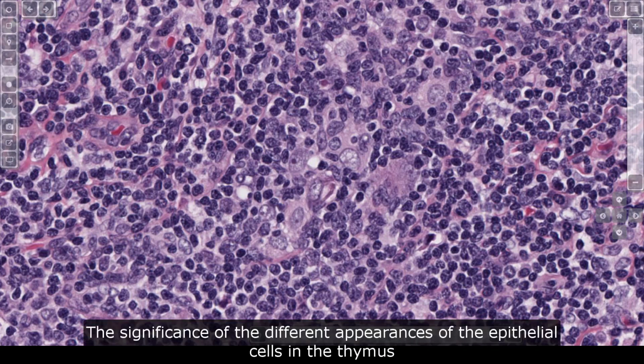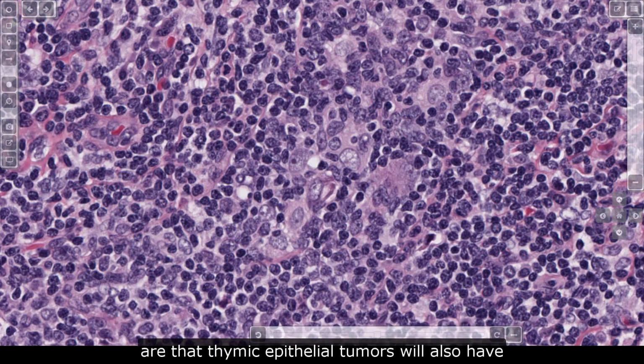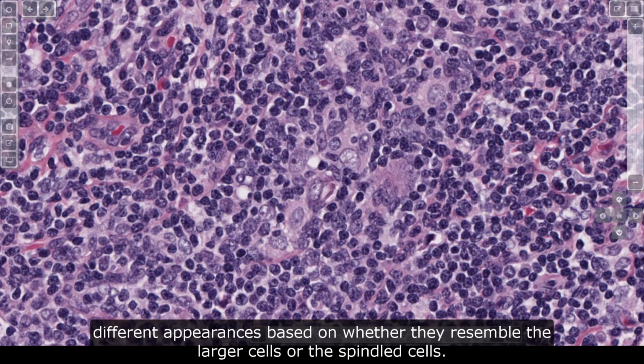The significance of the different appearances of the epithelial cells in the thymus is that thymic epithelial tumors will also have different appearances based on whether they resemble the larger cells or the spindled cells.